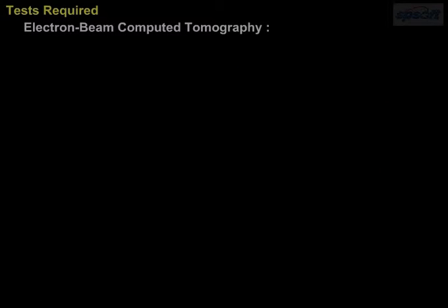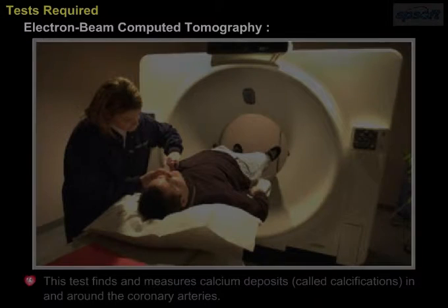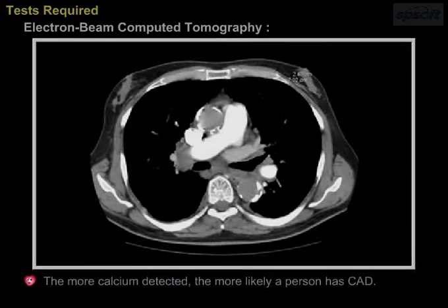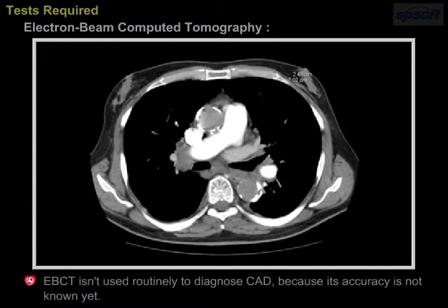Electron beam computed tomography. This test finds and measures calcium deposits, called calcifications, in and around the coronary arteries. The more calcium detected, the more likely a person has CAD. EBCT isn't used routinely to diagnose CAD because its accuracy is not known yet.